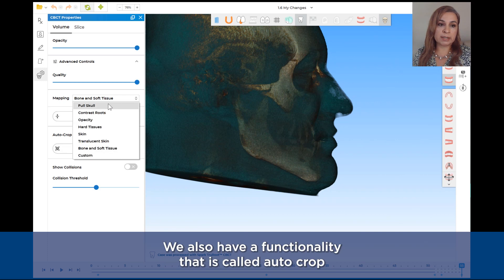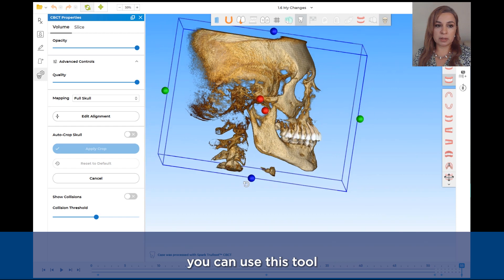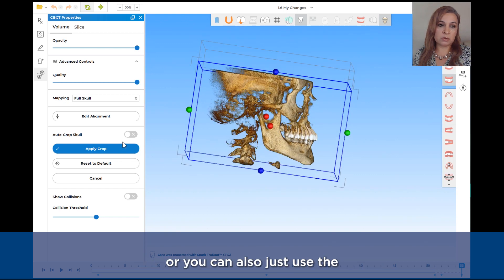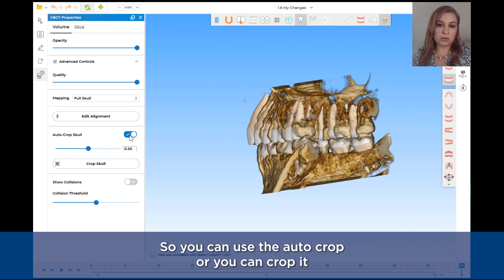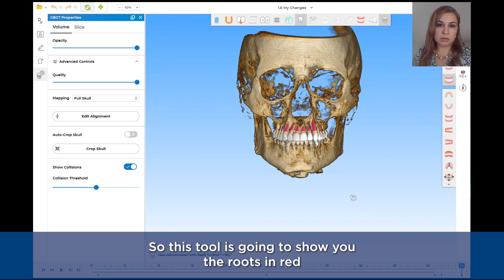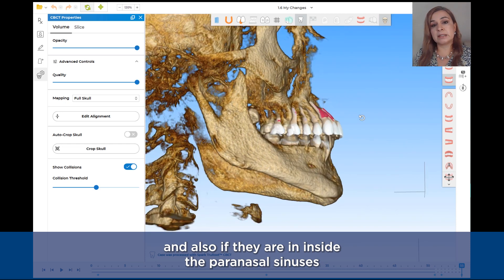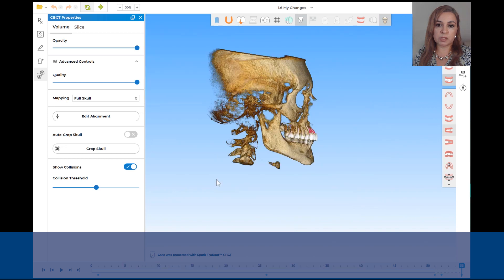We also have a functionality called auto-crop. If you want to focus on the maxilla or the mandible, you can use this tool and with these control points select the area you want to visualize — you can do it manually or use the auto-crop functionality and the skull will be cropped automatically. The next tool in the volume is Show Collisions, which shows the roots in red when they are in collision with the cortical bone, or if they are inside the paranasal sinuses or the incisive canal in the palate.